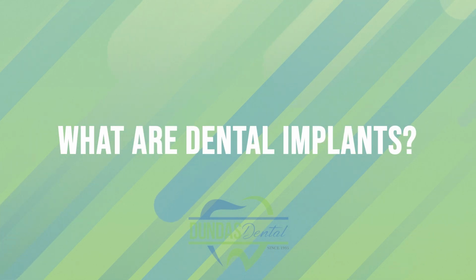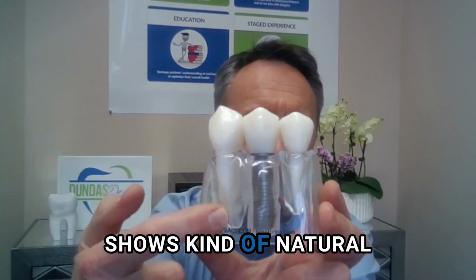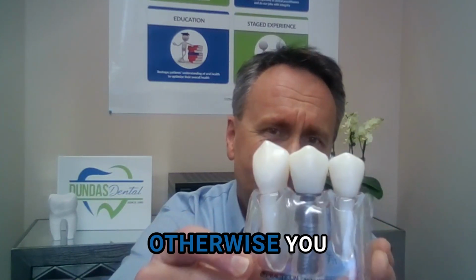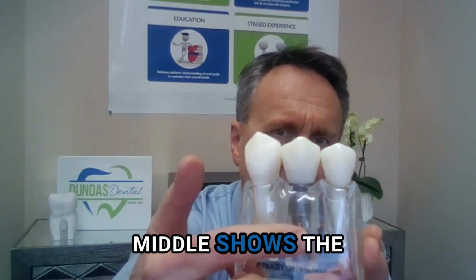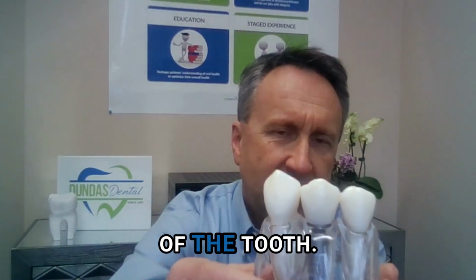What are dental implants? Dental implants are simply tooth replacement. This little model here shows kind of natural teeth. This clear part would represent bone and gum. We don't have the natural colors, otherwise you wouldn't be able to see it. And the one in the middle shows the dental implant. So what the implant does, it simply replaces the root of the tooth.